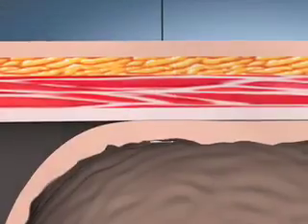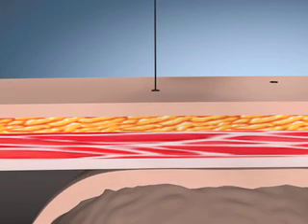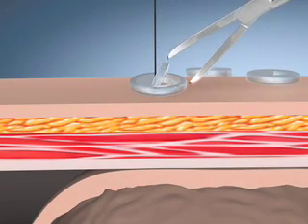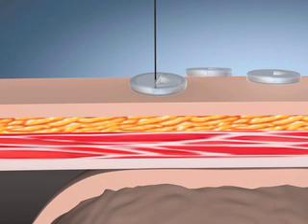Gently slide the suture lock down to the abdominal wall. A small hemostat may be clamped above the suture lock to temporarily hold it in place. Repeat the procedure until all 3 devices have been inserted in the corners of the triangle.